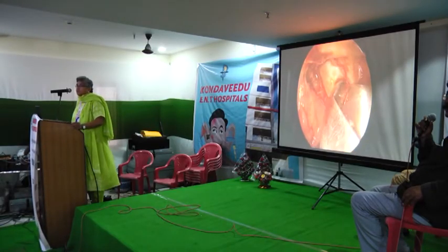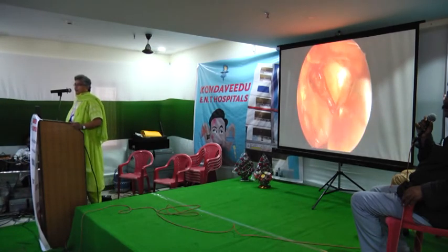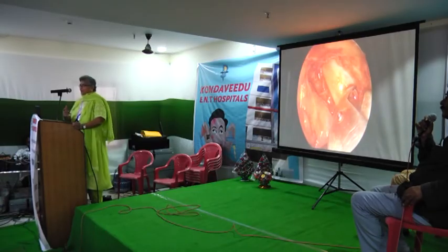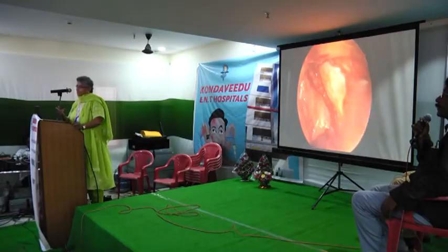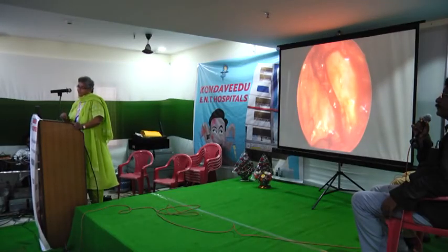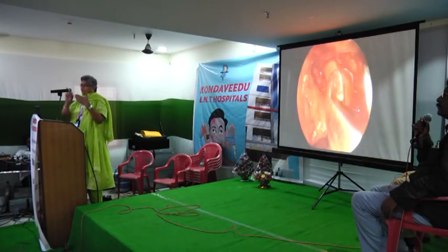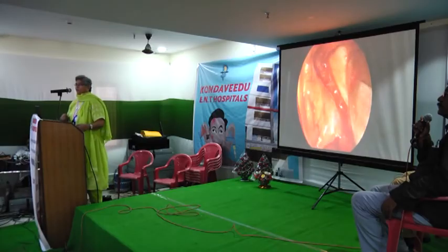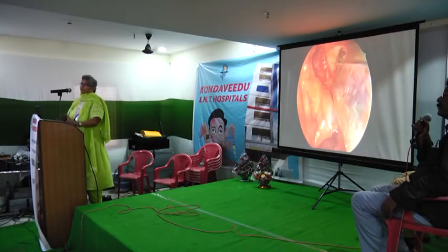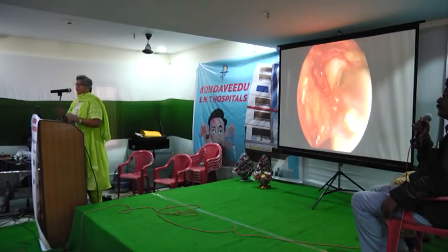A lot of them are there. I improved it; I put very simple tubes also. Like an IV set tube, we can cut a sterile IV set tube and place it from the lacrimal opening where we take the anastomosis, just from the anastomosis to the nose, with one suture here and one suture there, absorbable suture. After that, we can pull it off. If we keep it for 3 or 4 weeks, that prevents fibrosis.